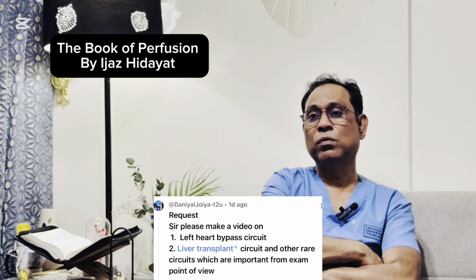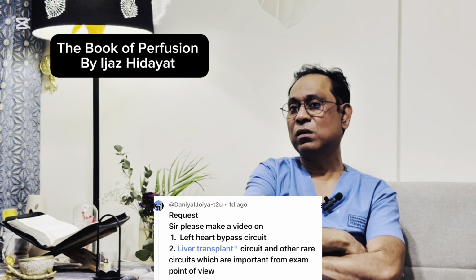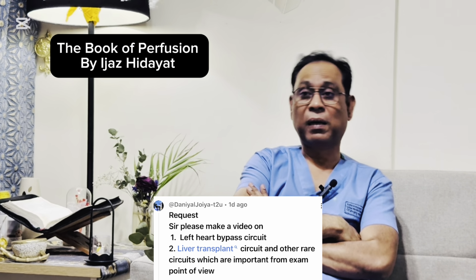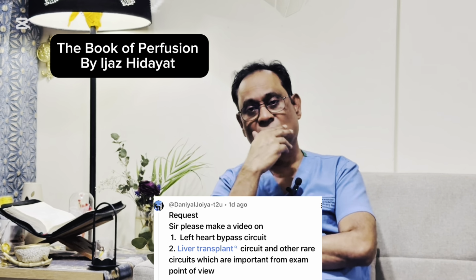Why? We need to perfuse the lower body, like the spinal cord, intestinal perfusion, and even the kidney perfusion. It is maintained by the left heart bypass. So this is, I think, the difference.